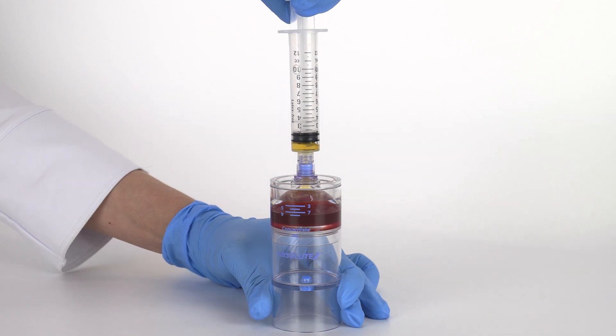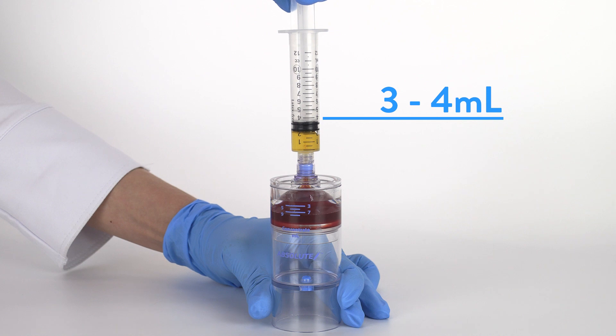Attach the 12-milliliter syringe to the needleless port and aspirate 3 milliliters or the desired amount of platelet-rich plasma.